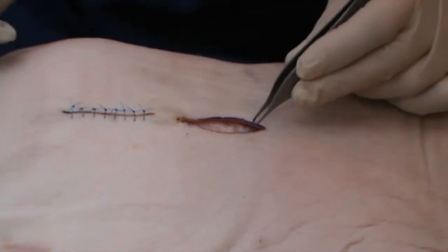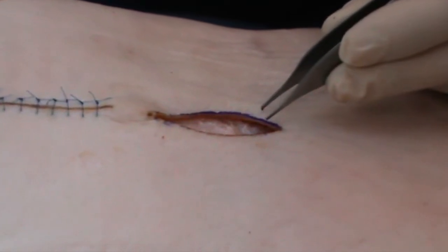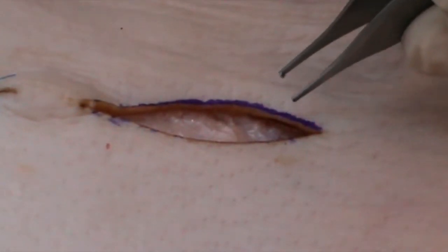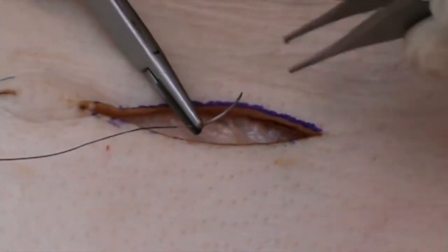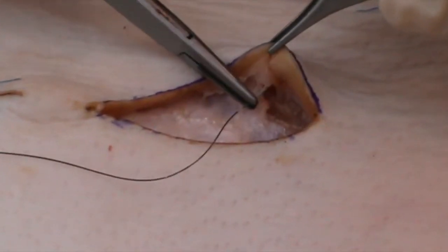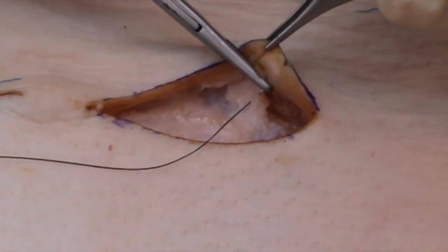Over here, we have exactly the same sized elliptical excision. This time I'm going to close it with buried or deep sutures. This is monocryl and I've pigmented the first section of it so that it is easier to see. To begin with, I'm just going to show what happens if you put in two or three such sutures.